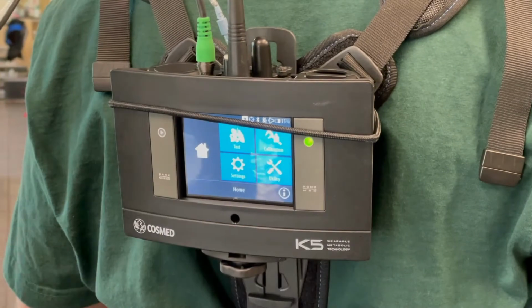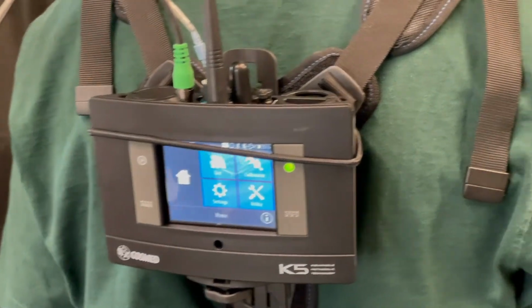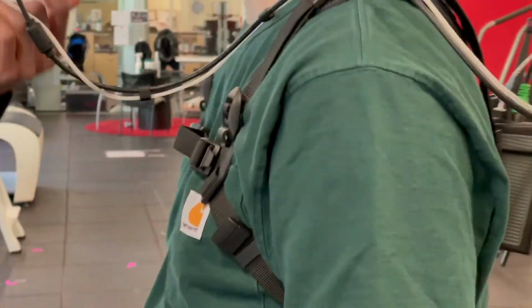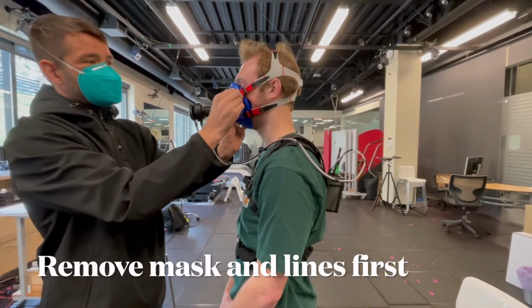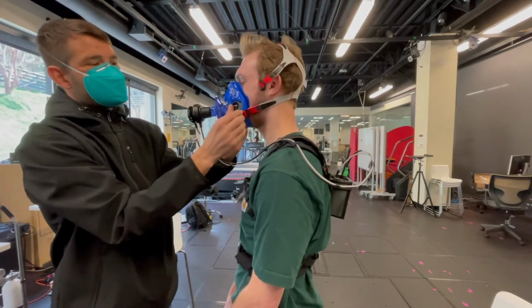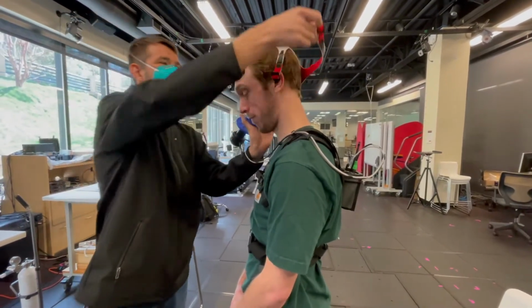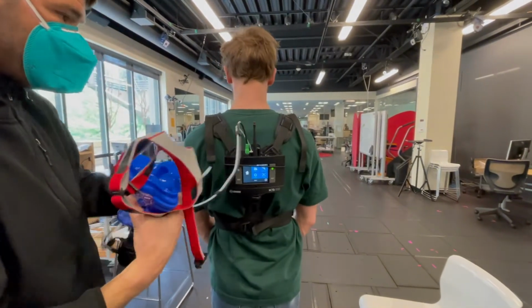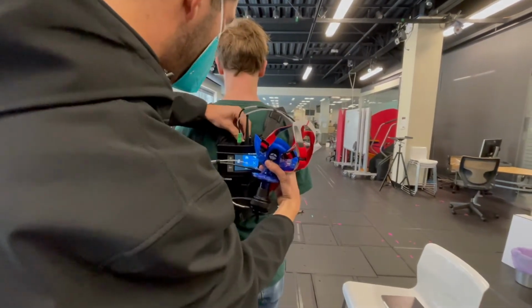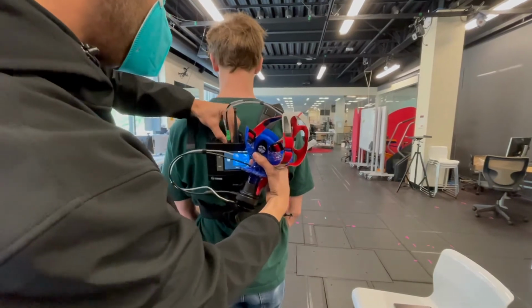So we can get him off the mask, and I'll have you just turn towards me. The best way I like to remove the mask, and this is just kind of personal preference, is just from the sides. So just taking the two sides off and allowing the mask to just get away like that. And this off.